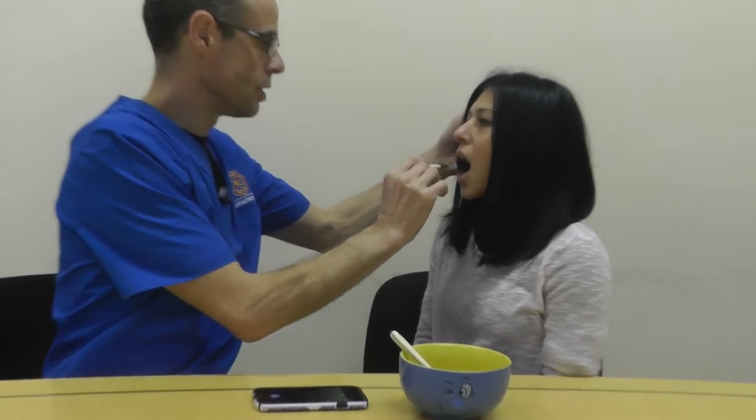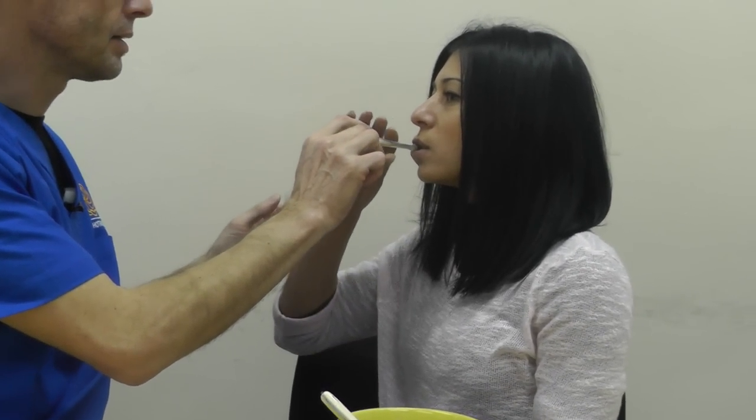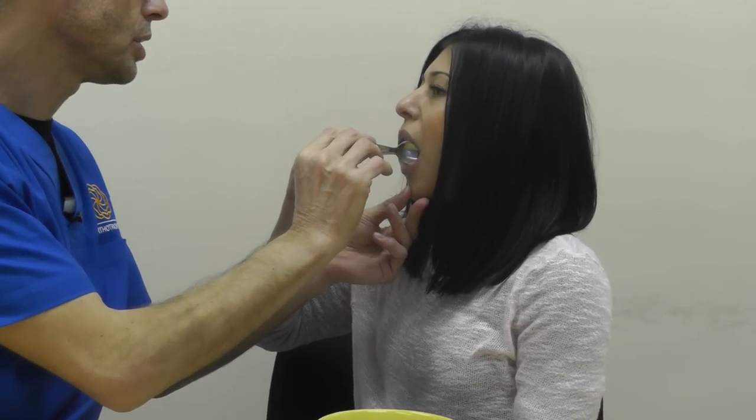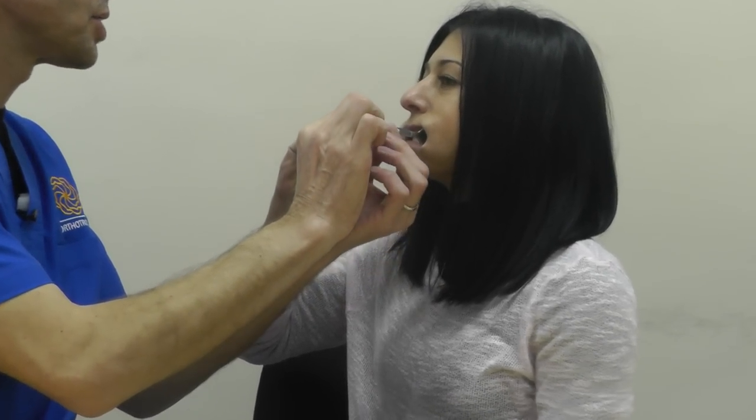First things first. Radha, if your face looks straight at me, open nice and wide. I'll put one spoon on your right-hand side — can you hold that? Then open nice and wide, relax your cheek, and I'll put one on the left-hand side.